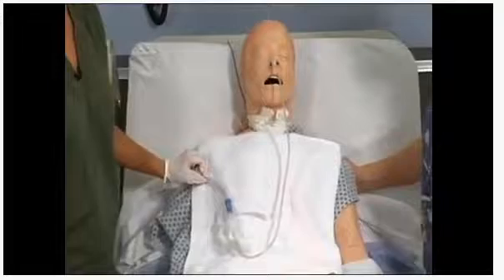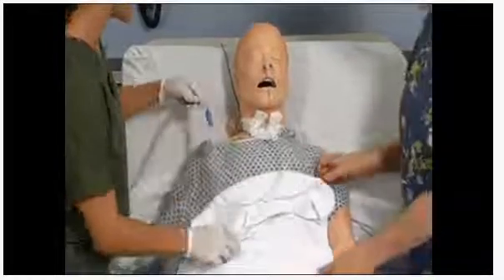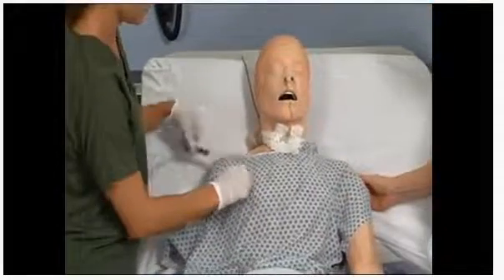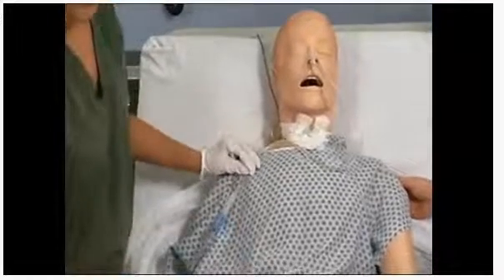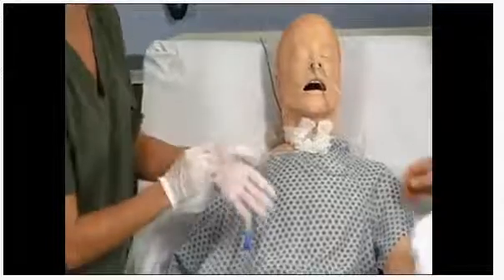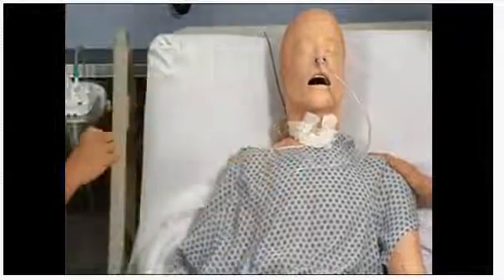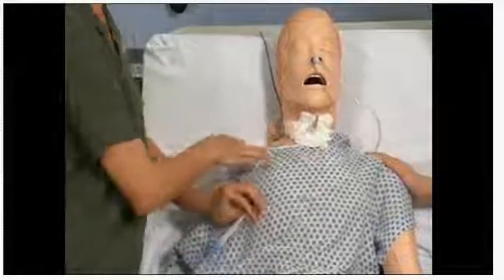Okay. Mrs. Jones, I am just about done. I'm just going to secure this. How are you feeling? Okay. Now what I want to go ahead and do, at this time if you need to, it may be a little bit easier without your gloves, and that's fine as long as you don't have any content. You can dispose of your gloves. And what I want to go ahead and do is secure the NG tube to the gown.